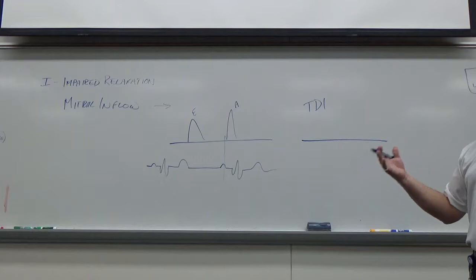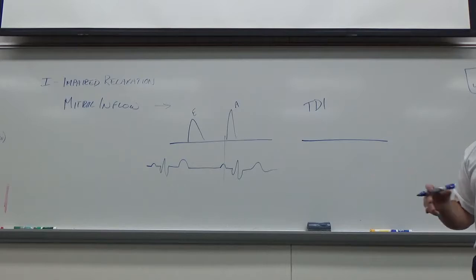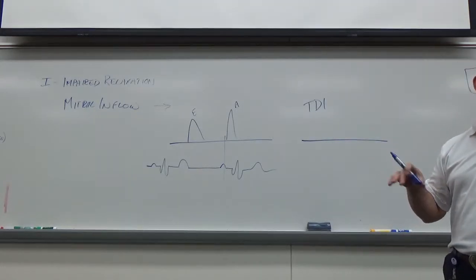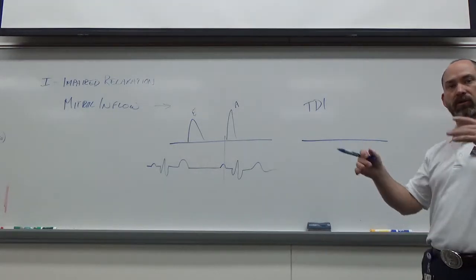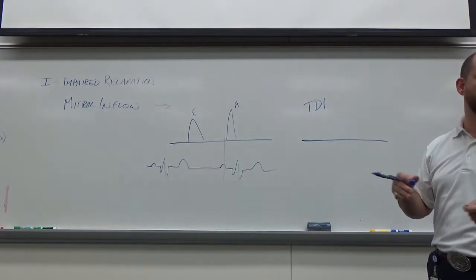You got to scan some renal parenchymal arteries last week, right? How was that? Is it hard? Very hard. The tinier the vessels, the more difficult it is. If your Doppler is set in the parameters that you need before you do the Doppler, you're much quicker to do some quick adjustments. Otherwise, you're going to have to make all the scale changes and baseline changes, and by that time you've lost the artery and you have to reobtain it.